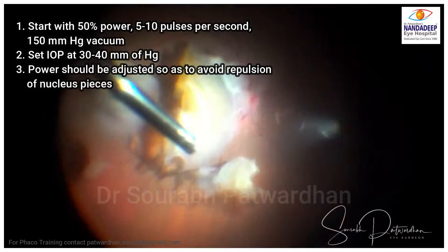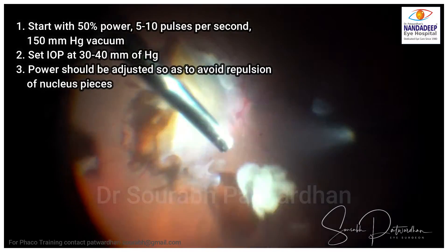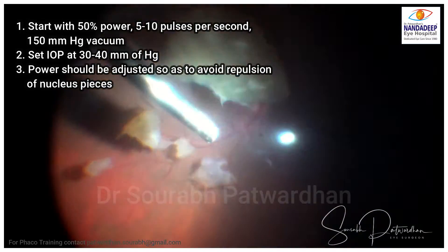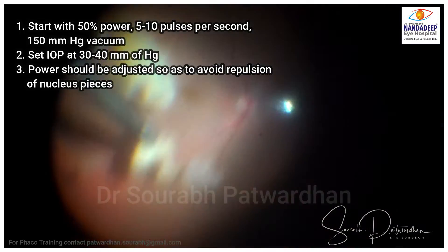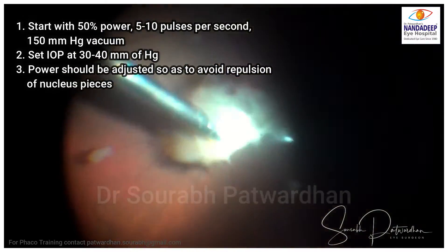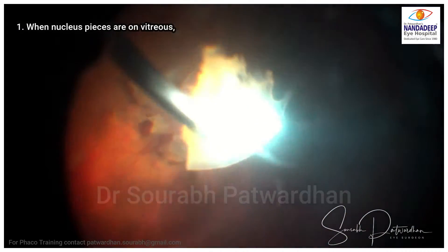Set the IOP at 30 to 40. The most important parameter to check is the power. If you keep higher power, there will be chattering and the followability of the pieces will be less. The idea is to keep the power optimum. Once you catch hold of the nucleus, you can emulsify most of it.